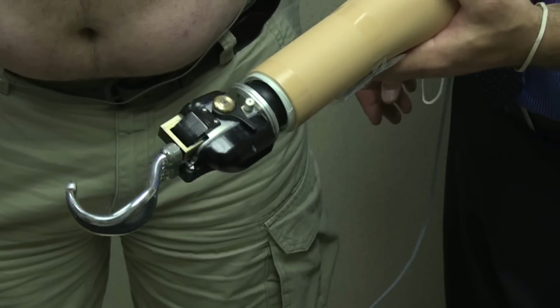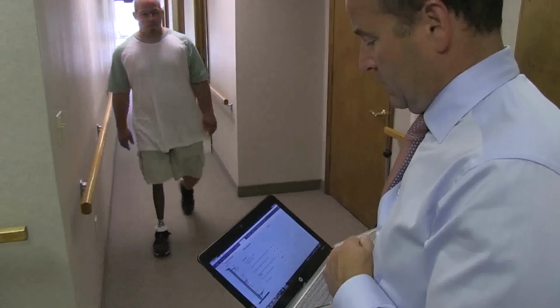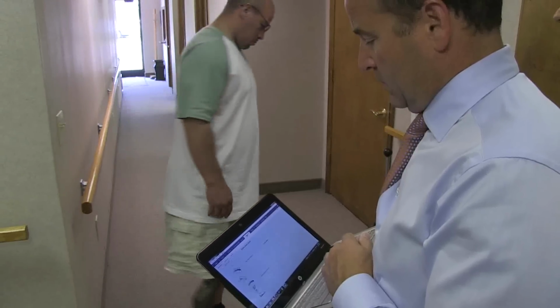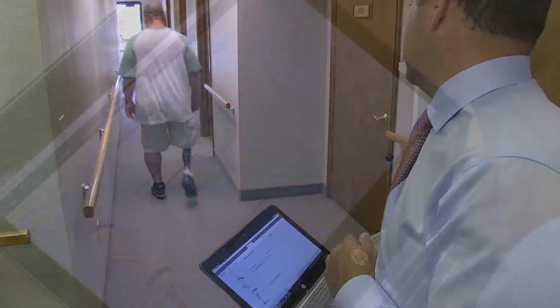Typically, when we discuss prosthetic components, most of the attention goes on the hardware, the feet, the terminal devices or hands, elbows. We pay attention more to that because that's typically what makes the headlines in the news. What we often forget about, though, and what I think is the most important part of the prosthesis, is actually the socket or the interface.